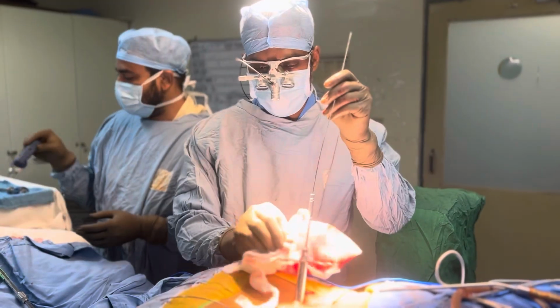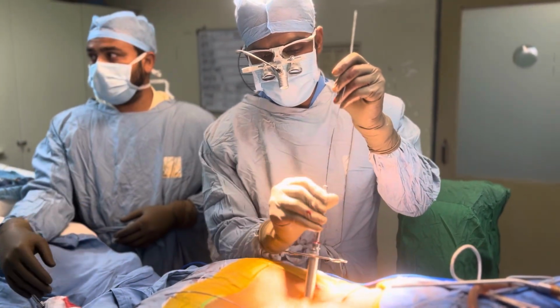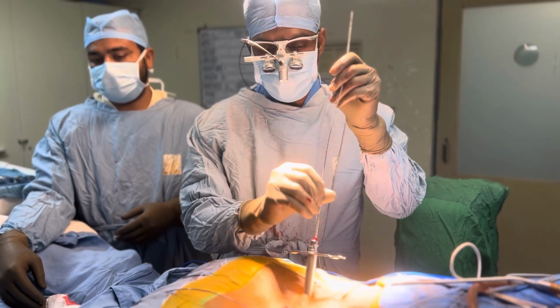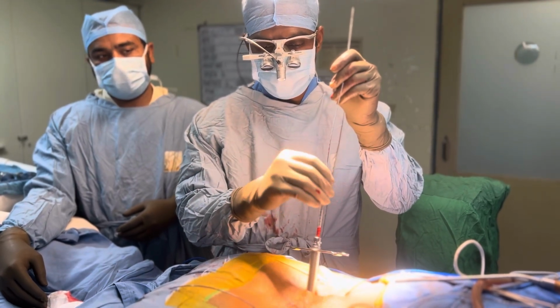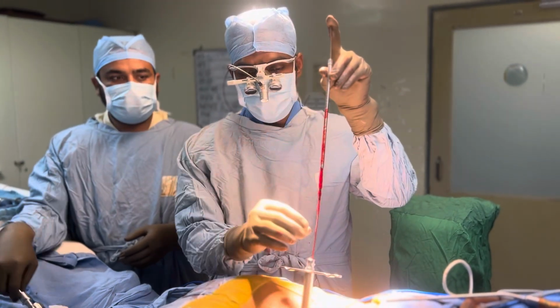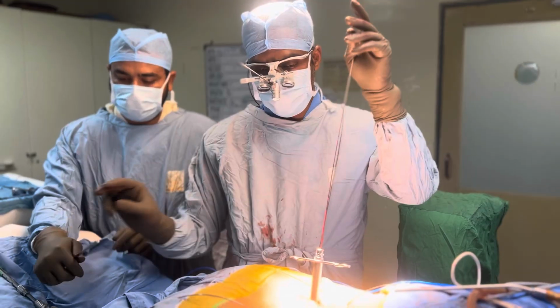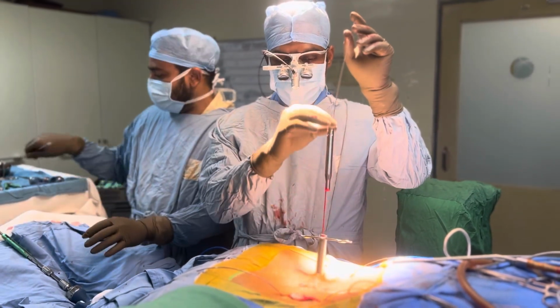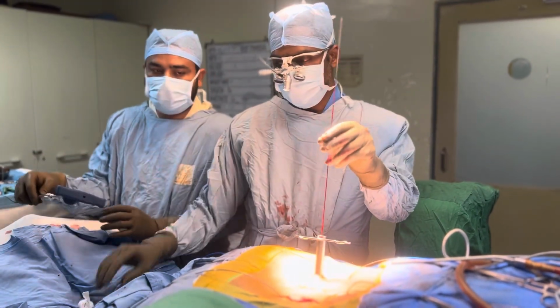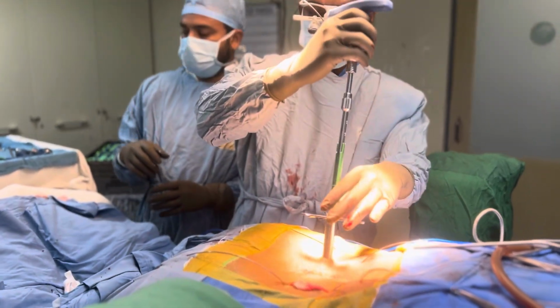Then one should hold the guide wire all the time so that it does not come back with the tap. Once the tap is a little bit out, you can rotate it with the hand so that it is easy to remove, and I am holding the guide wire all the time so that it does not come back. Now the second sleeve is also removed and the screw is being placed on the guide wire.